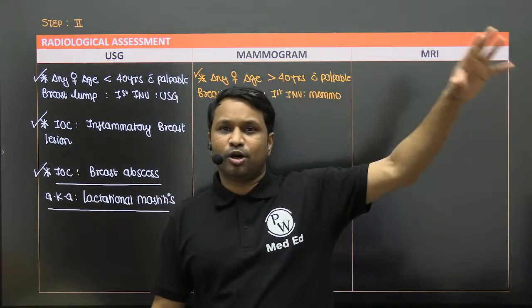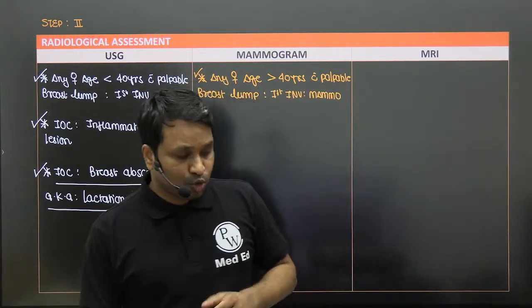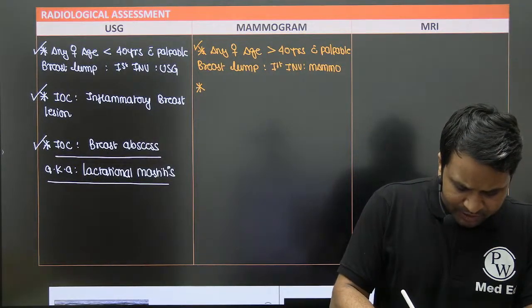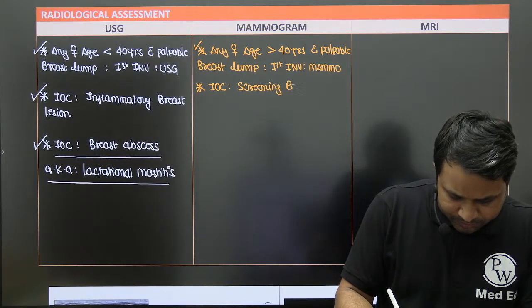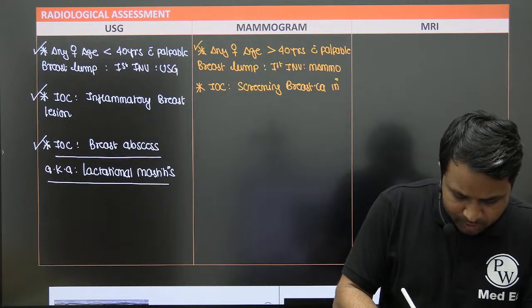Again, ultrasound is operator dependent, mammography is not operator dependent. So another reason to choose mammography over that, right? So when it comes down to mammography, currently mammography is considered the investigation of choice for screening breast cancer in the general population.